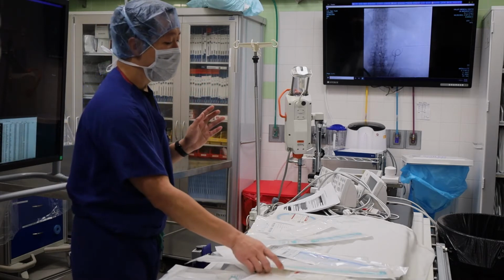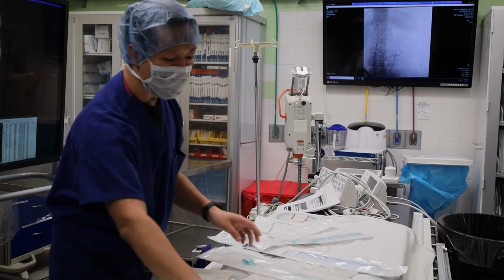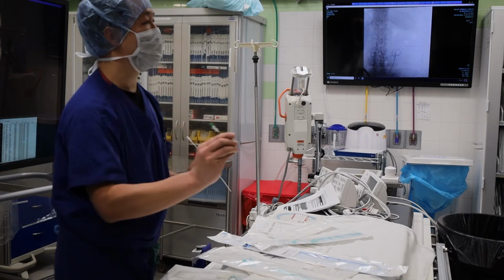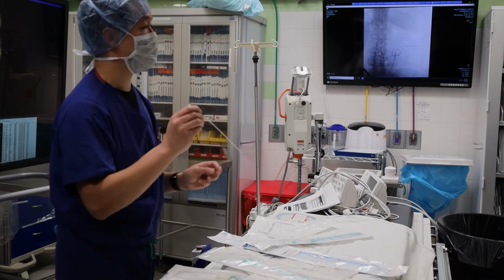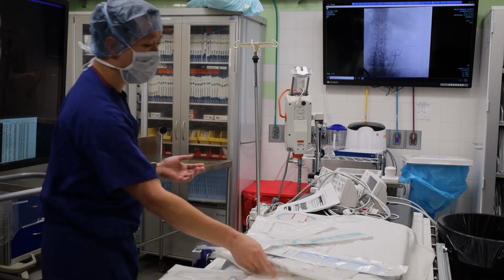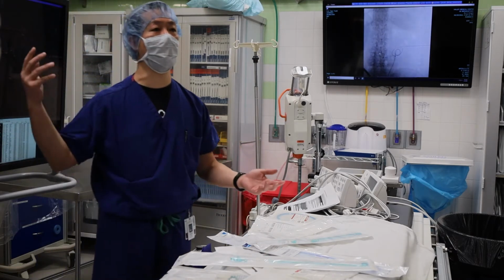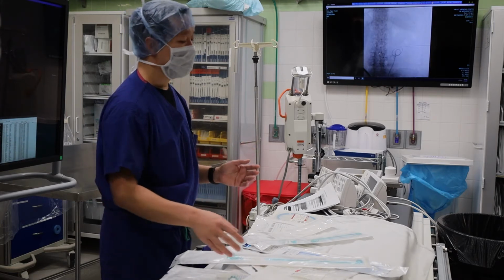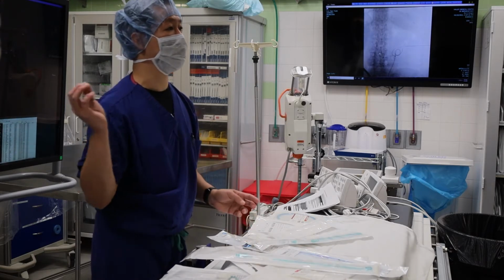The reason why we oftentimes urge urgency when we're doing this is that when you put this in, you take this out over the wire, pus is now leaking into their body. And then you put this in, it clogs the hole. Now you've got a 6 French hole, take this out. Now we're like, oh crap, we didn't open a perc Neph. Oh, okay, let's go over to the shelves. Oh, it's in the other, oh, it's in the hallway. The whole time, the person's getting worse and worse and worse. Okay? So always have this thing ready because you just want to minimize the time between the exchanges.